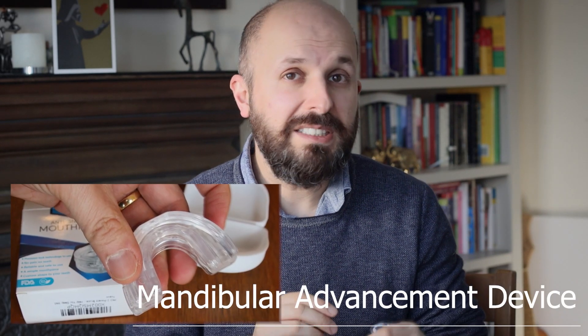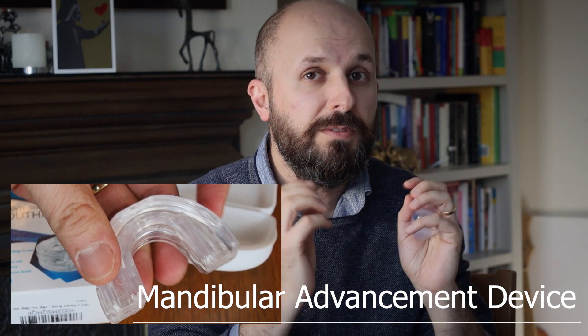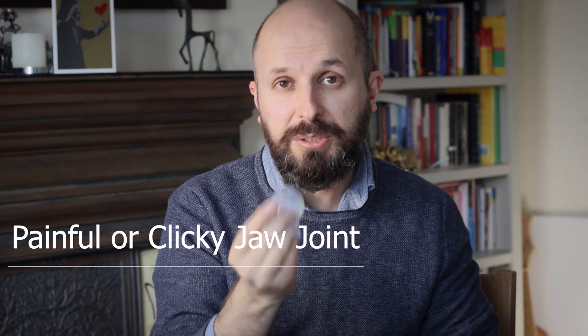Some of you may have heard of the mandibular advancement device, which is basically a gum shield that brings your lower jaw forward — pulling your lower jaw forward and at the same time pulling your tongue forward. But some people don't have adequate dentition to use that, or they have temporomandibular joint problems, so the tongue retaining device is an alternative, because it doesn't rely on pulling your jaw forward — it pulls your tongue out directly.